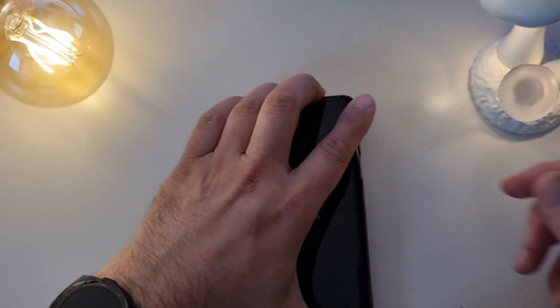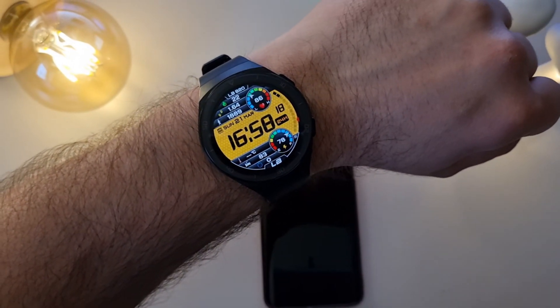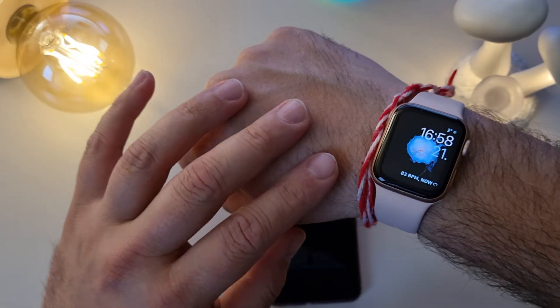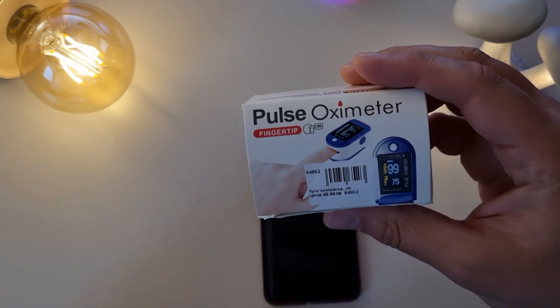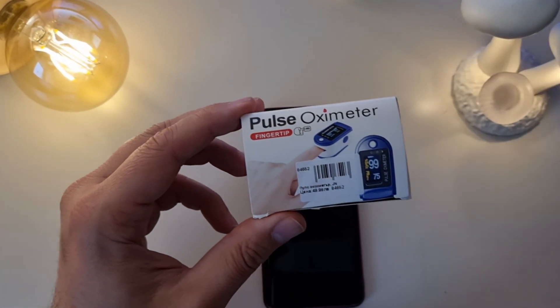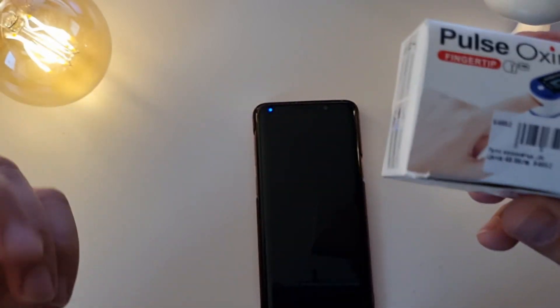I have here the Samsung S9, and you know the sensor on the back measures SPO2, heart rate, and pulse. I also have the Huawei GT2e watch on my left hand, the Apple Watch 6s on my right wrist, and a regular pulse oximeter. There are several ways to measure SPO2 — the most common way is to use a pulse oximeter.